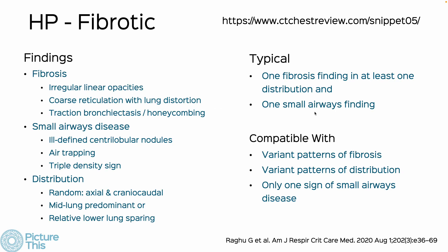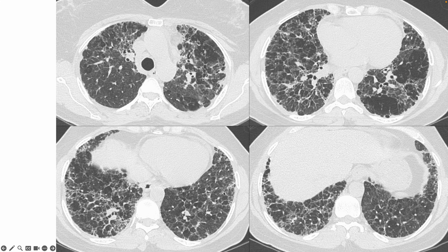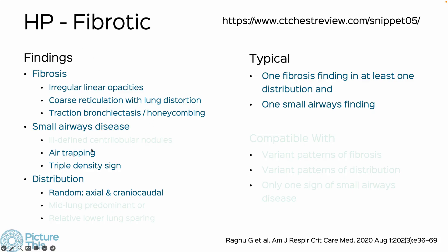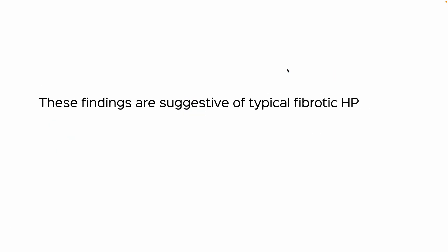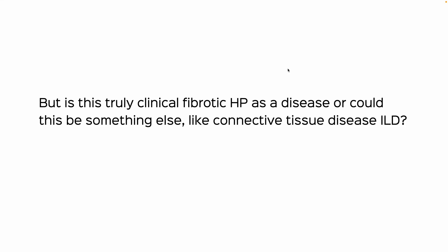Looking at the 2020 criteria for hypersensitivity pneumonitis, a diagnosis of typical fibrotic HP requires fibrosis in any of these distributions plus one finding of small airways disease. We can see the triple density sign — lucent lung, ground glass, normal lung — as well as widespread areas of air trapping, suggesting a small airways component. This gives classic findings of typical fibrotic hypersensitivity pneumonitis.